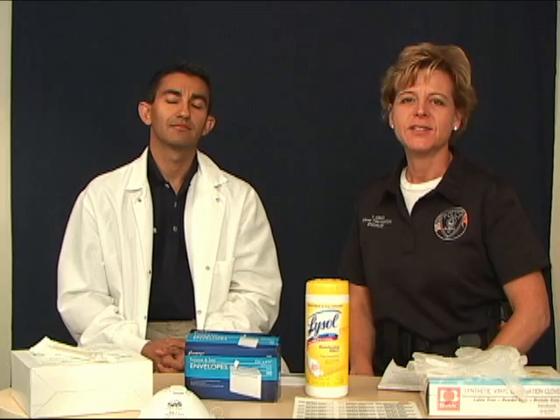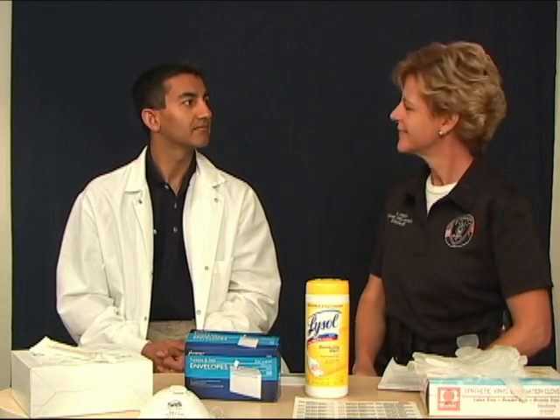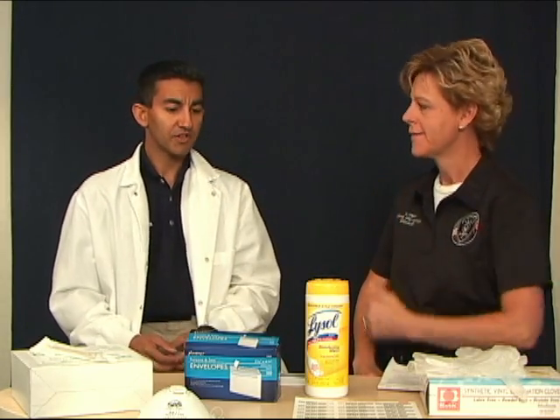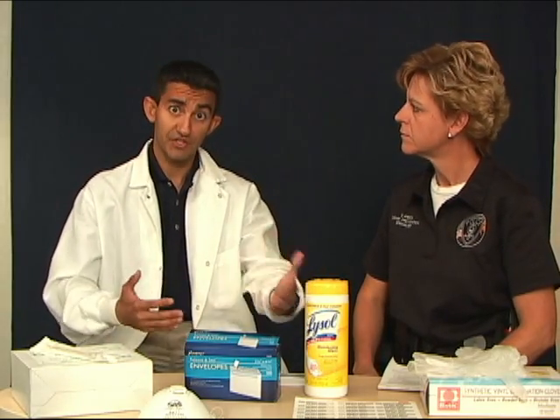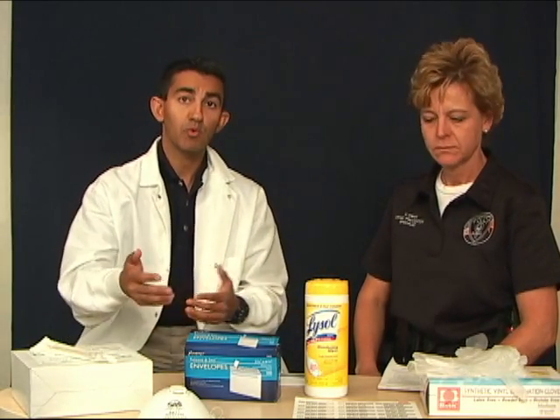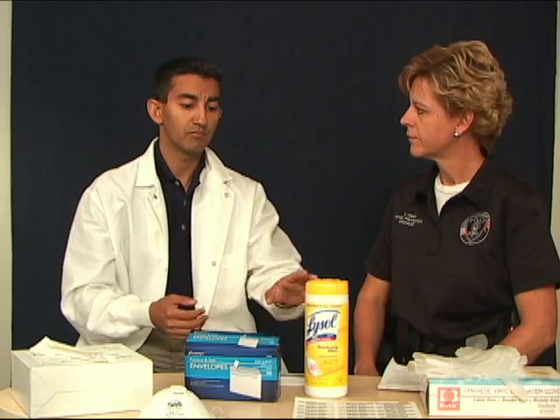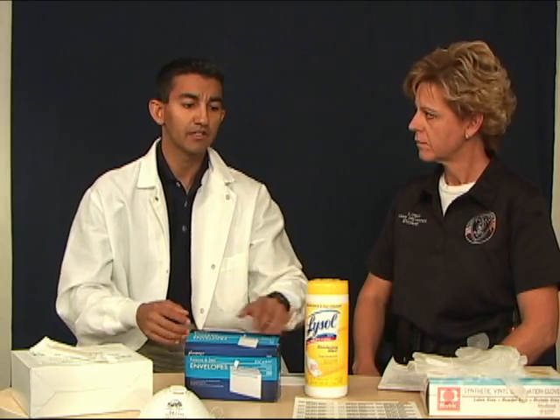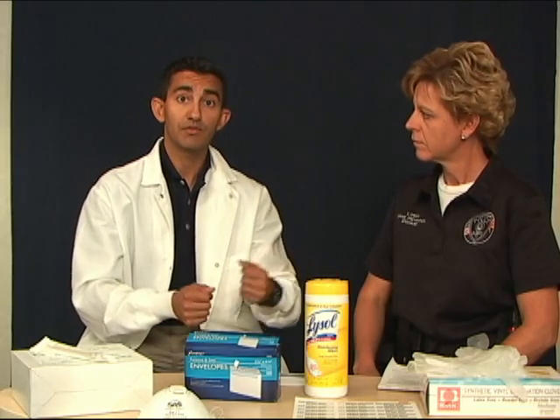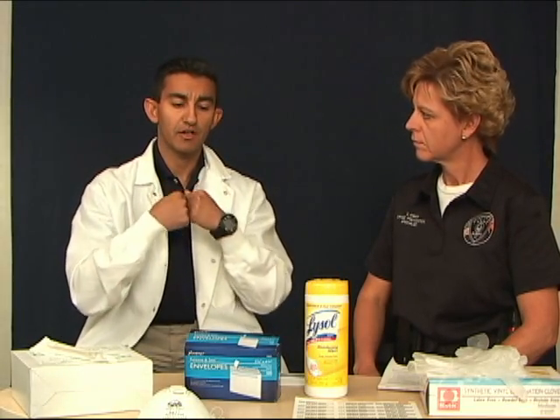All right, we're going to go ahead and show you how to do a DNA sample here. Amir's going to do that for us. Sure, absolutely. What you want to start off with is cleaning the area. We're going to assume that this area is clean, but I've just cleaned it right now. Before you even get to the cleaning, you want to put gloves on first, clean the area, and then take those gloves off, put new gloves on, and put your mask on.